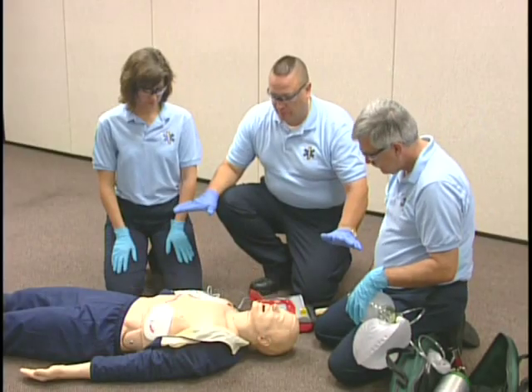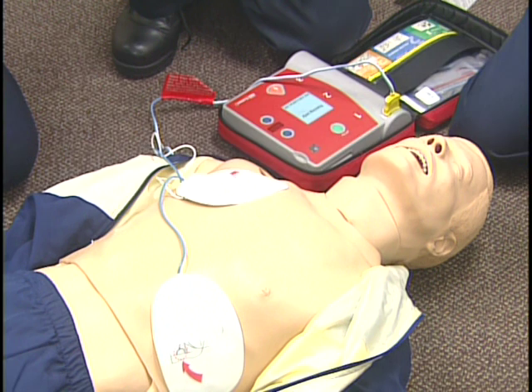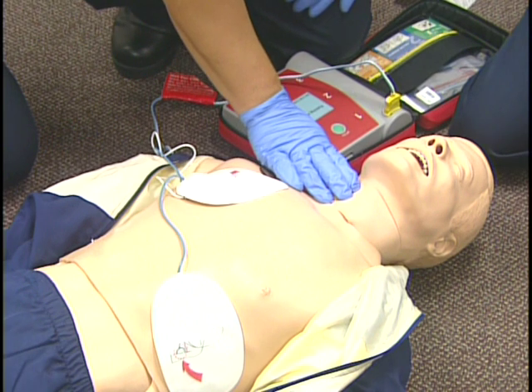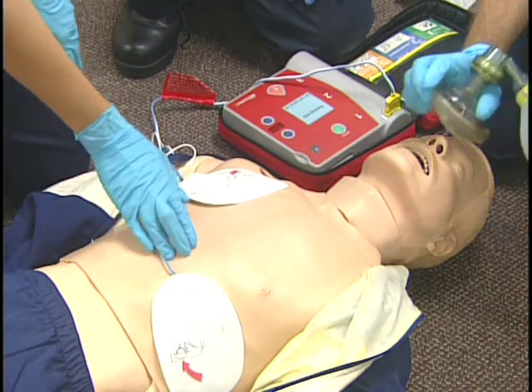Now let's look at a scenario where the AED advises no shock. Analyzing heart rhythm. No shock advised. Check the patient's pulse. If no pulse is present, perform CPR for 2 minutes and recheck the pulse. Reanalyze the rhythm. Deliver shocks as advised by the AED.